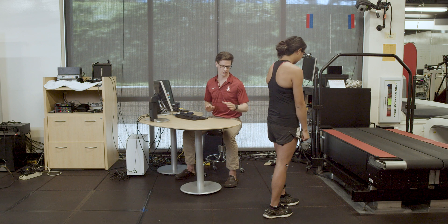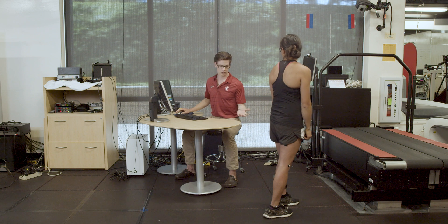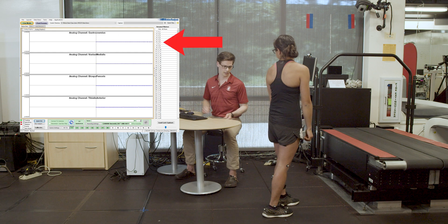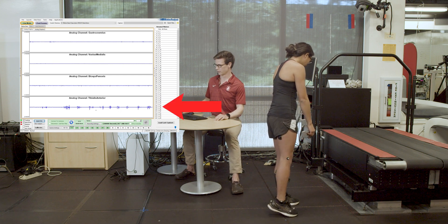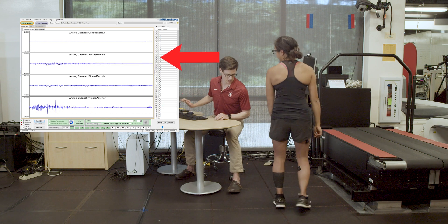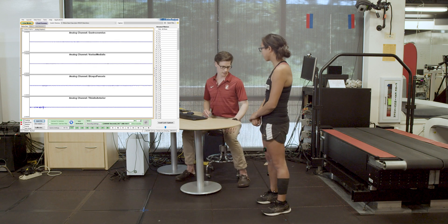We've placed the electrodes on Hannah's muscles and now we want to check that we have a decent signal. We'll have Hannah do some activities to activate various muscles: a calf raise to activate her gastrocnemius, toe tapping to activate the tibialis anterior, a squat for the vastus medialis, and then knee flexion with resistance for the hamstrings. We can see each muscle activating on screen, and we have pretty good signal coming from the EMG.